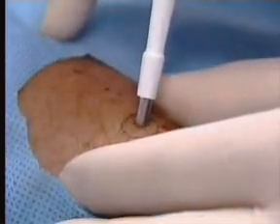Take the punch — in this case a 3.5 millimeter punch that will encompass the entire lesion — place it over the mole and push down with gentle pressure while spinning the punch.